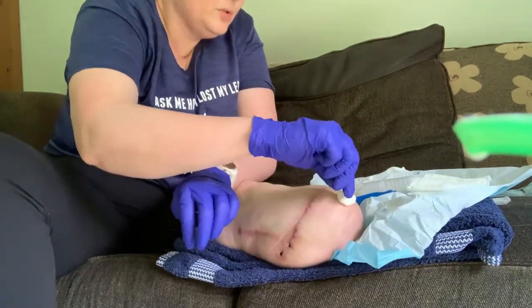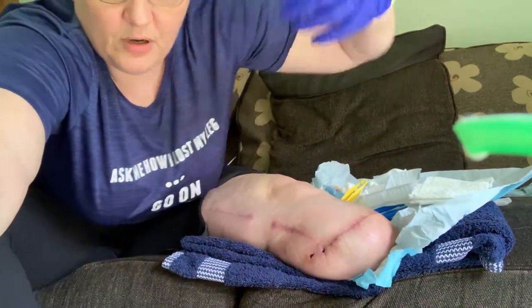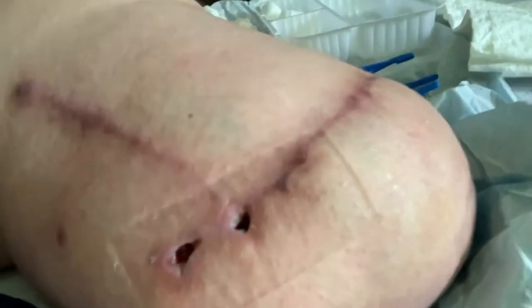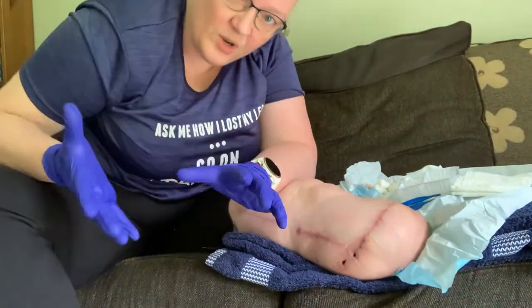I'm going to show you these wounds close up — they look pretty clean. I'm not going to touch the camera with my hand or use my left hand. There is the wound — it's looking pretty clean. And there's the one around the end — it's looking pretty clean. Just trying to minimize the amount of contact I have with other things.